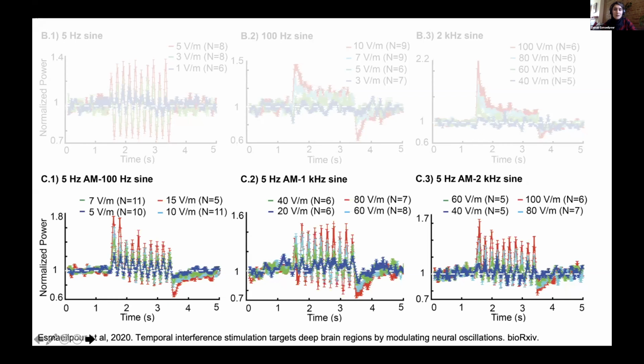And in order to quantify our responses here, we introduced 2 different measures, dynamic modulation and static modulation. Technically, dynamic modulation captures the fluctuations of the power in the amplitude modulation, which is like the ratio of the peak to the trough. In order not to include any artifact, we started quantifying that for the second half of the stimulation. So all the results are from the time 2.5 to 3.5.